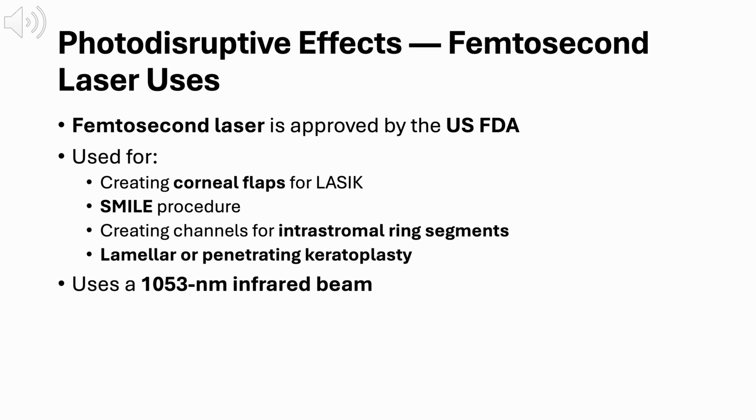Now let's talk about photodisruptive effects and femtosecond lasers. Unlike excimer lasers, which reshape the cornea by removing tissue at the surface, femtosecond lasers work by creating precise tissue separation within the cornea. They deliver extremely short pulses of energy that produce a localized mechanical effect rather than thermal damage. Femtosecond lasers are FDA approved and are used to create LASIK flaps, perform the SMILE procedure, and form intrastromal channels for corneal ring segments.